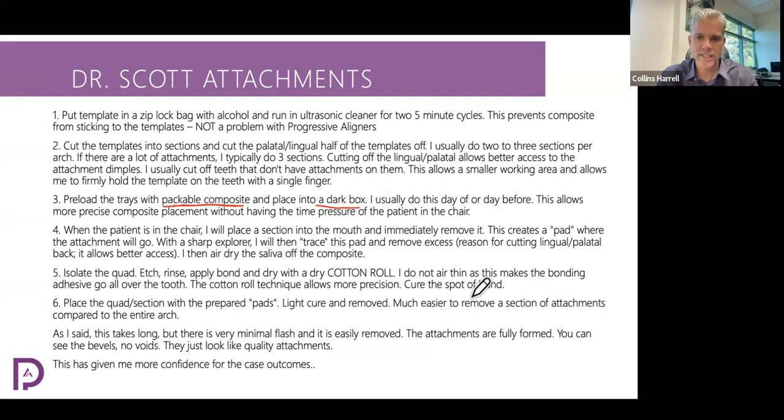And he says he usually does this the day before treatment. I usually do it just before the patient comes. Okay, but I agree that doing this ahead of time is a nice way to do it. He says when the patient's in the chair, I place a section into the mouth. So let's say he takes the upper right side. It's already been filled with this packable composite. It's not cured yet. And he puts it into the mouth and seats it down all the way. And this creates essentially a custom fit pad onto the tooth where that needs to bond.